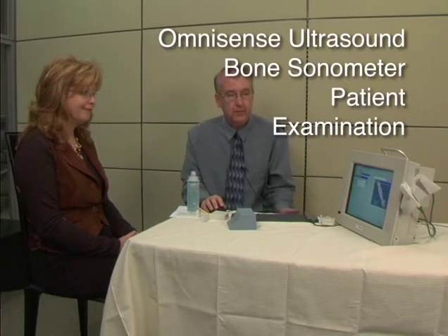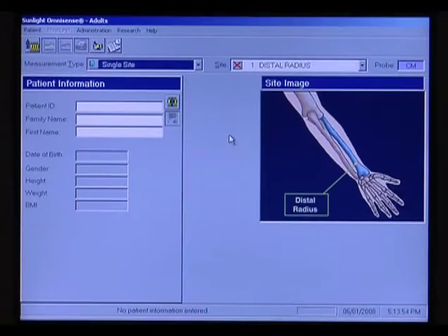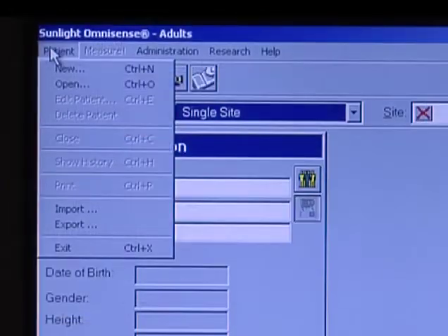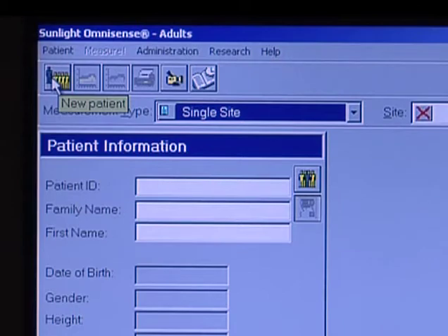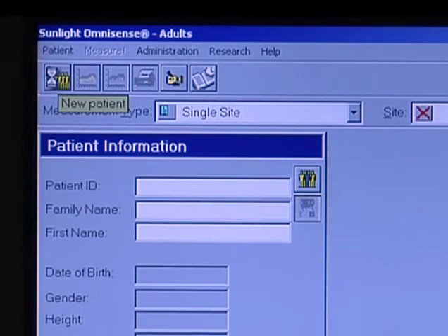First, what we need to do is make sure that there is a patient file open. So if we have a new patient, we have some options here. We have the new patient icon, or we can just go up to the patient drop-down list and choose new. I'm going to click the new patient icon.